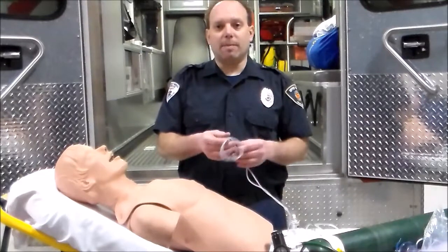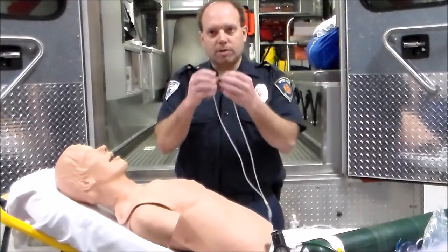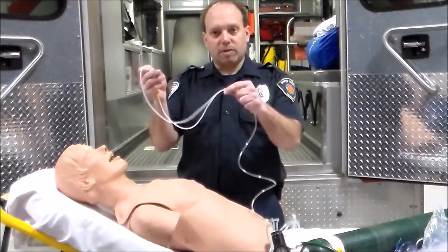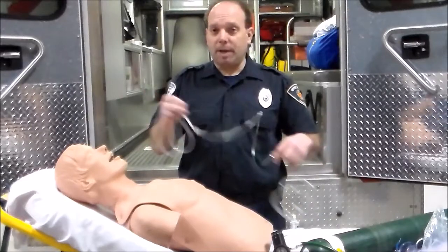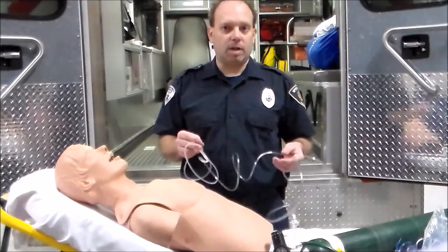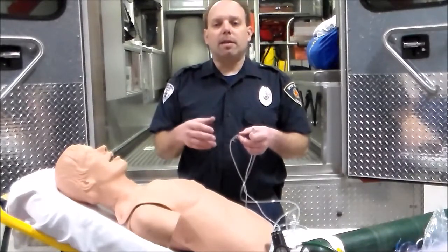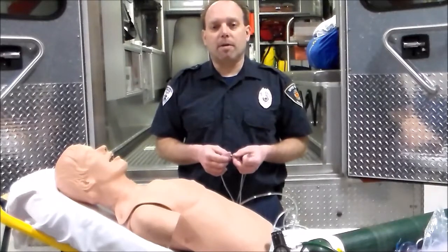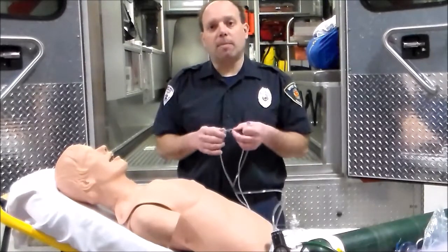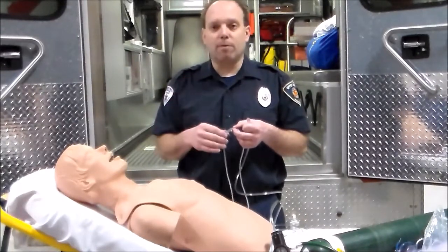The first thing we're going to look at is the administration of oxygen through nasal cannula. Nasal cannula has two little nasal prongs that go into the patient's nose, then loop around their ears and tighten up. It flows anywhere from one to six liters per minute, typically giving around 40% oxygen concentration. This is used for individuals with mild shortness of breath — if pulse oximetry is around 90 to 93%, you start here and titrate the liter flow up until you achieve at least 94% or greater.